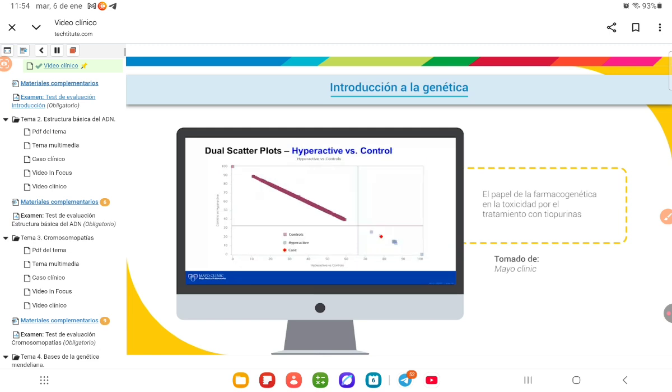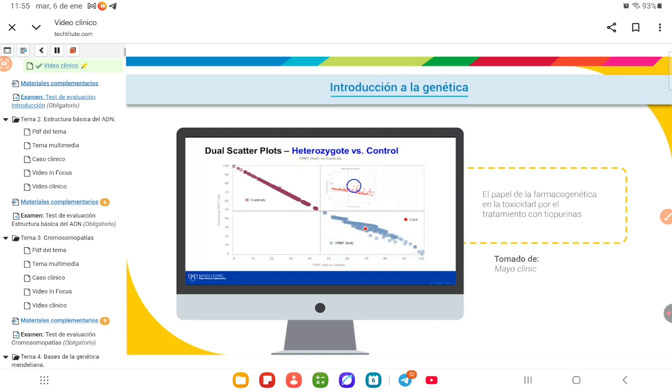A dual scatter plot is actually needed for better definition of hyperactive cases in comparison to normal cases. To generate this plot, all controls were added to the database as individual cases, and a single condition tool was created. But the far most relevant scatter plot is the one designed around the critical need to segregate TPMT heterozygotes from controls. While the indeterminate quadrant appears empty based on confirmed cases, this is a process that determines the reporting of a case as indeterminate when found through prospective testing or clinical samples.